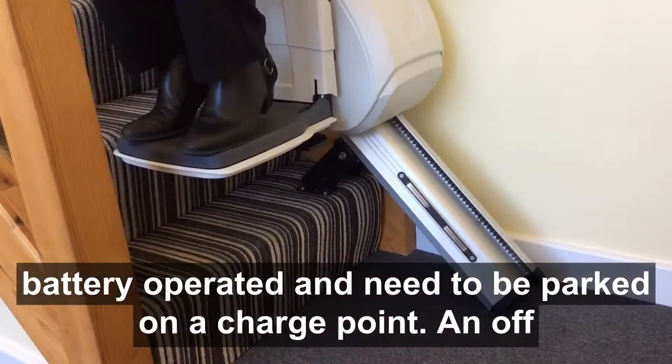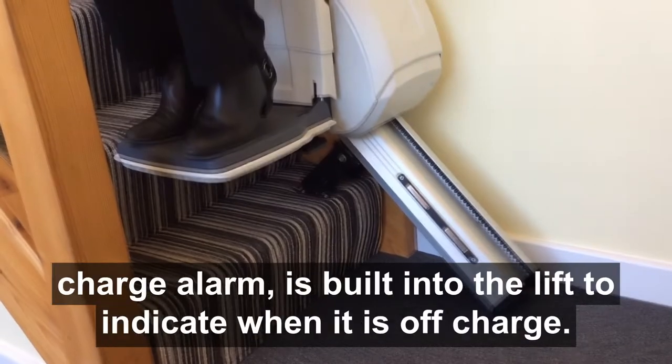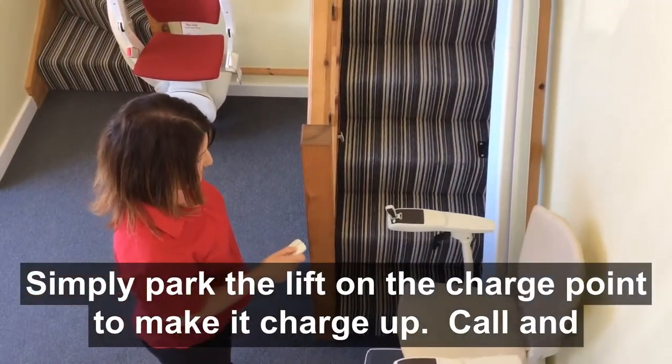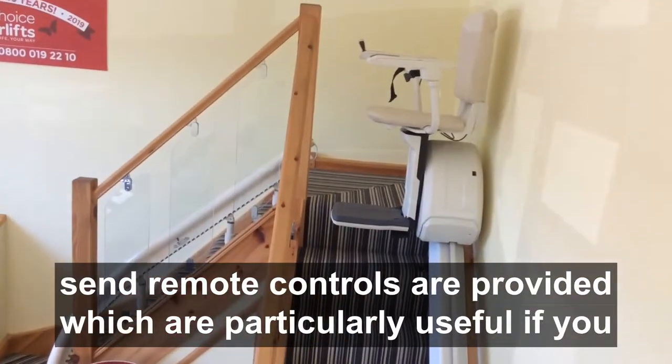All lifts are battery operated and need to be parked on a charge point. An off-charge alarm is built into the lift to indicate when it is off-charge. Simply park the lift on the charge point to make it charge up.